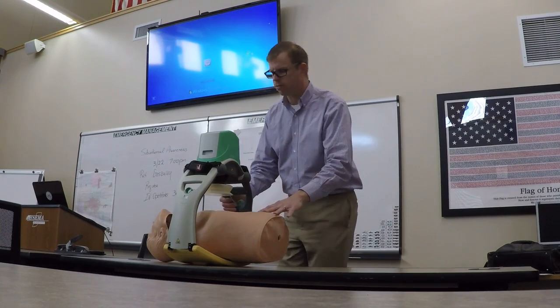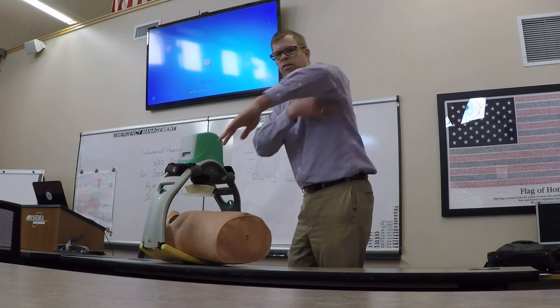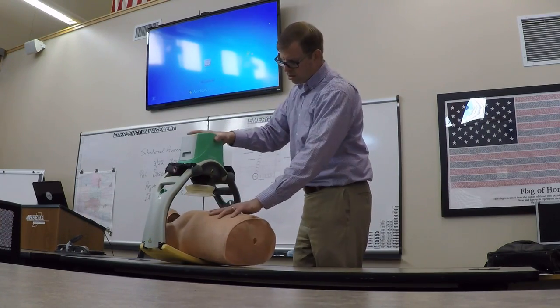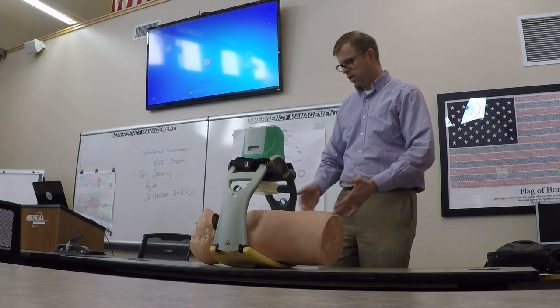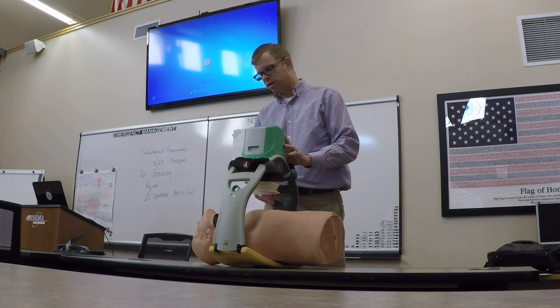Then we verify we're in the right spot. If we're not, we just shimmy the device up until it hits the armpits, and then we're right where we need to be. You don't have to take time to move the patient around — the backboard just slides up really easily underneath.